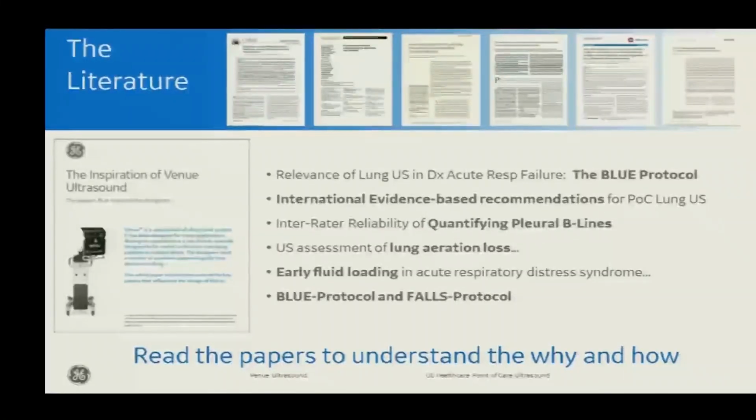In developing Venue, we literally read hundreds of articles and talked to hundreds of physicians around the globe. So what I'm recommending to you here is that you dig into these articles. You have a list of some of the key articles that we studied available to you. Here I've just listed some of the most pertinent ones for B-lines. I would really recommend that you read these, because the more of the literature that you take the time to review, the deeper your understanding will be.